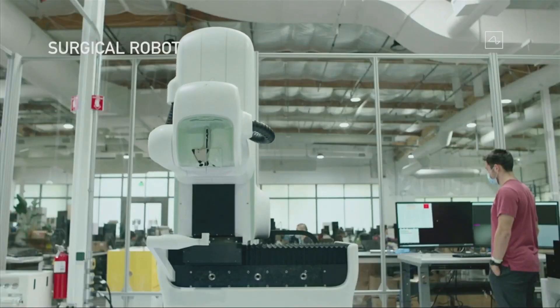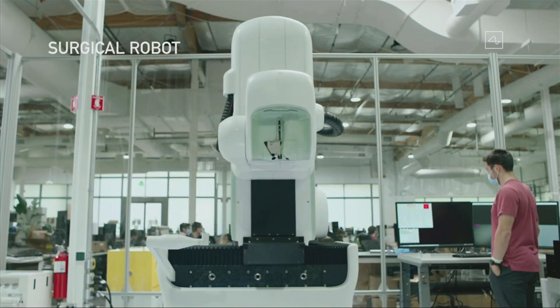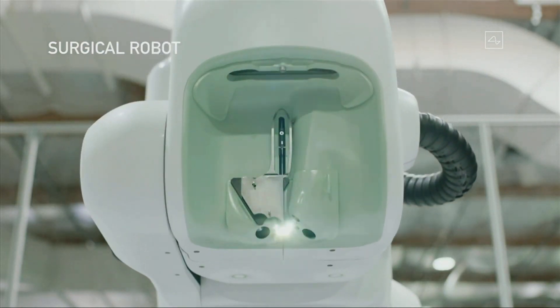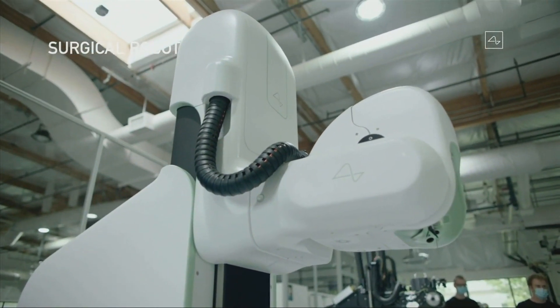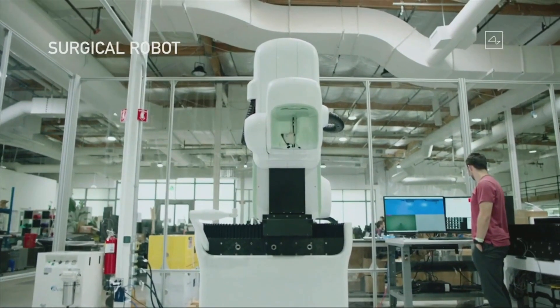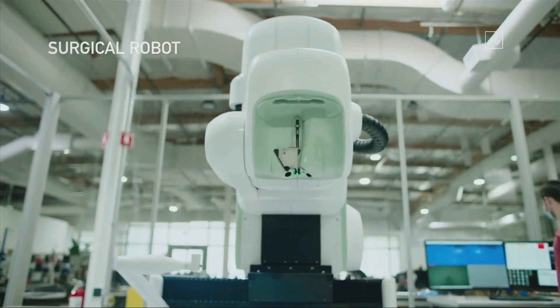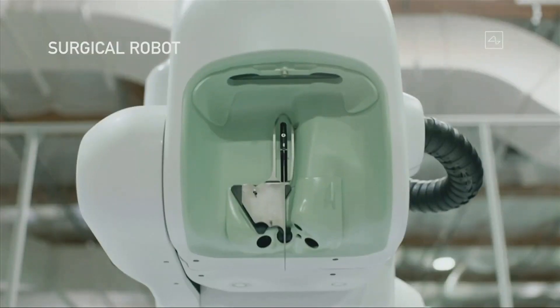This is our surgical robot, and we ultimately want this robot to do essentially the entire surgery — everything from incision, removing the skull, inserting the electrodes, placing the device, and then closing things up and having you ready to leave. We want a fully automated system.